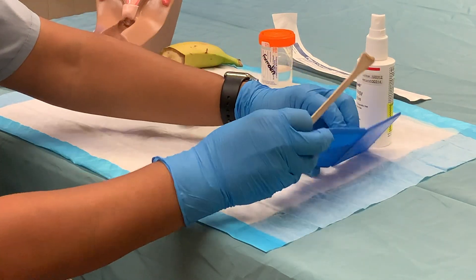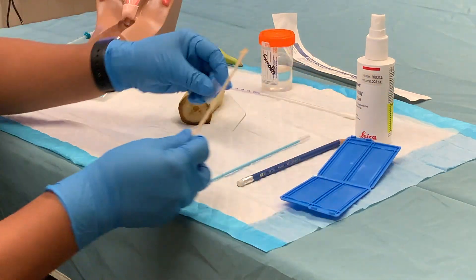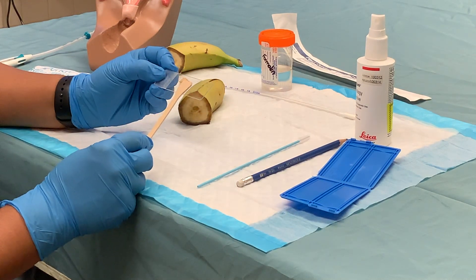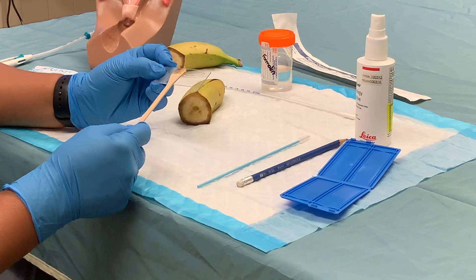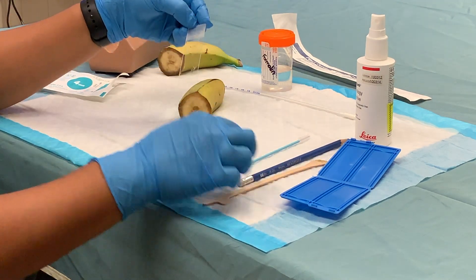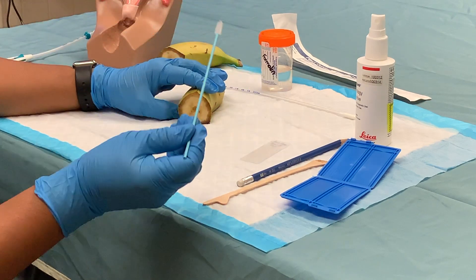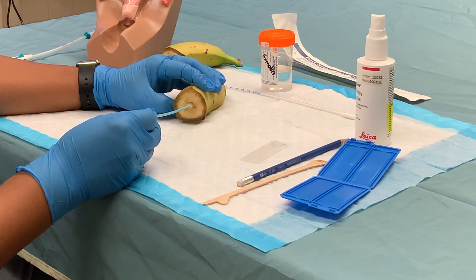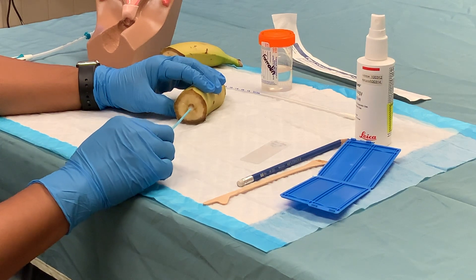Once they have obtained a sample from the cervix or the banana, they will spread the tissue like this on the slide, which has two identifiers on it. And then they will take this side of brush, insert it directly into the external os, and rotate it 180 degrees.